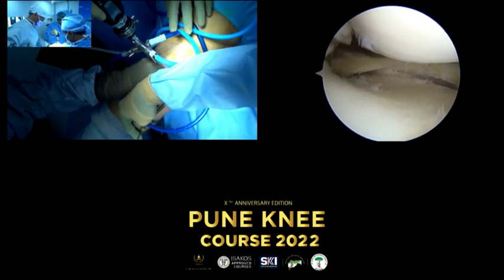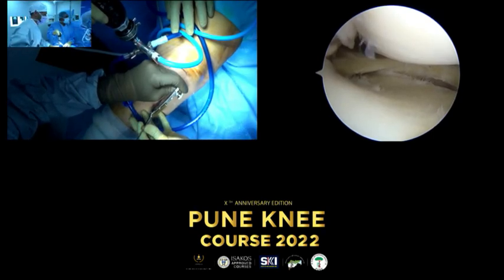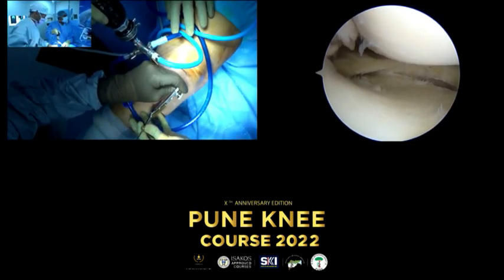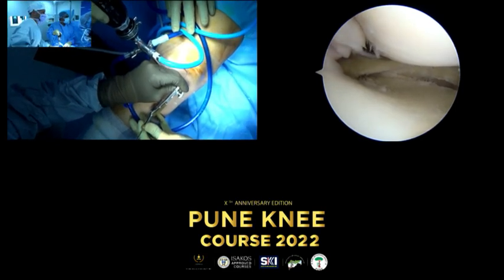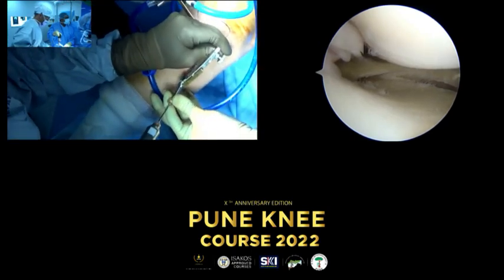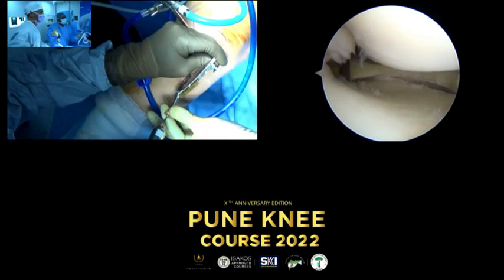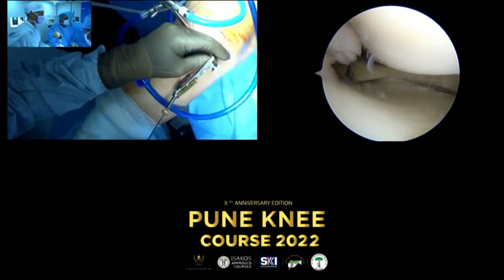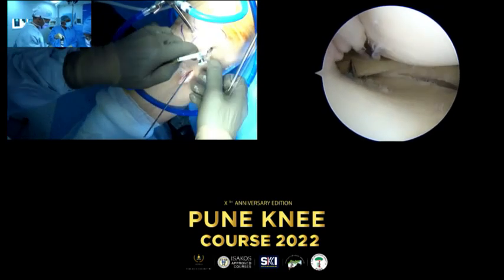Fingers crossed. This is probably the most important aspect of the medial. I think probably it's hitting against the screw and deviating the... I like it here. I'm sure there is something with the screw. Yeah, because I'm right there.